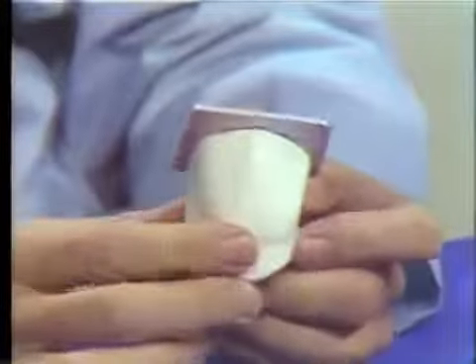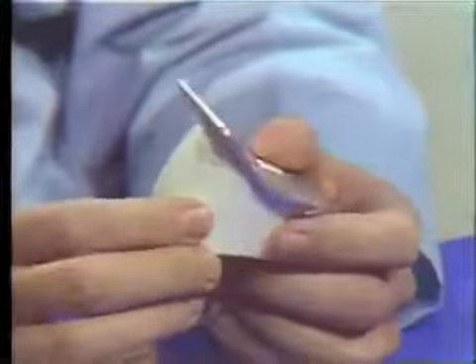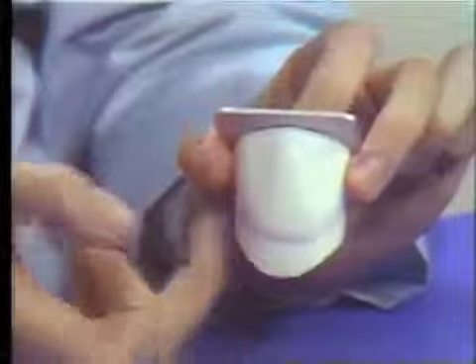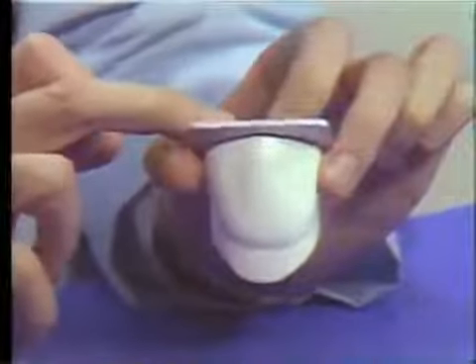This is for a bicuspid. Similar ones are used for the molar teeth. It has the advantage, you see, of placing porcelain against the fitting surface and against the axial surfaces, gold being only on the occlusal surface.